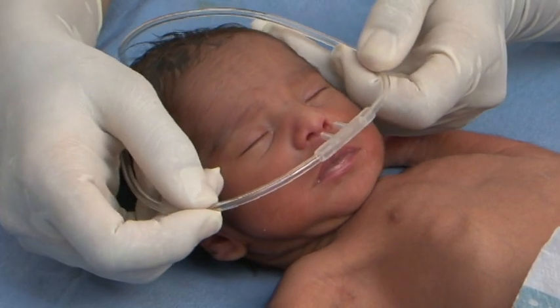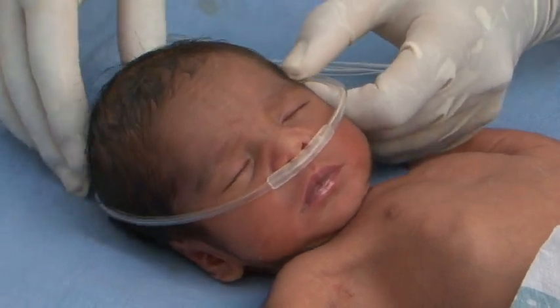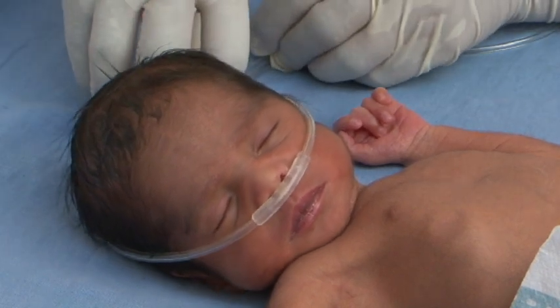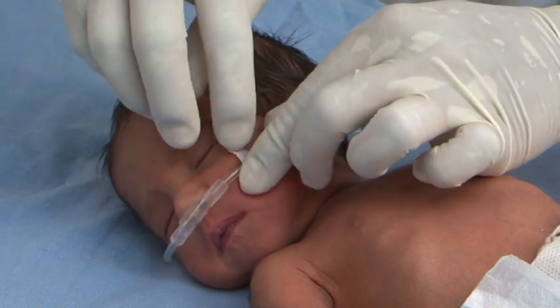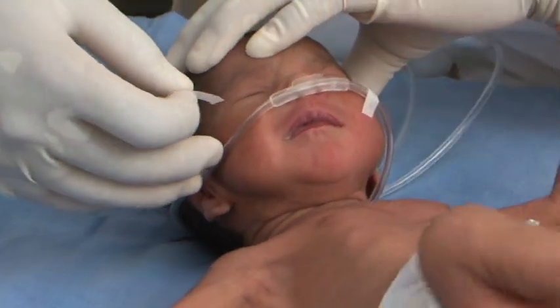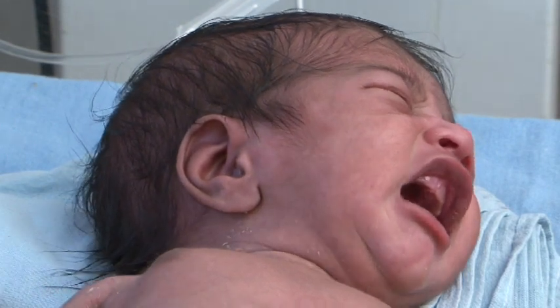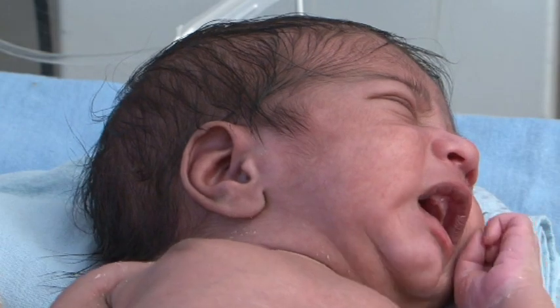Place them just inside the nostrils and secure with a piece of tape on the cheeks near the nose. Take care that the nostrils are kept clear of mucus, which could block the flow of oxygen.